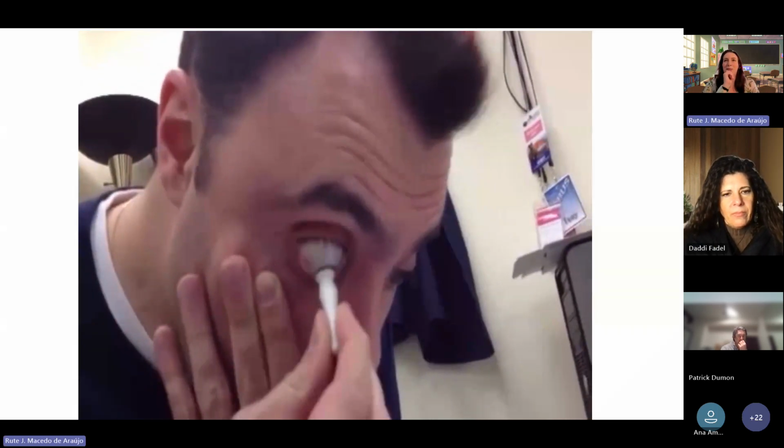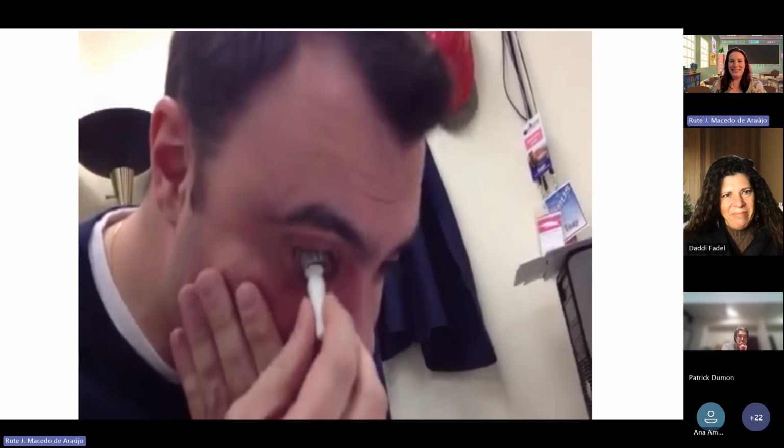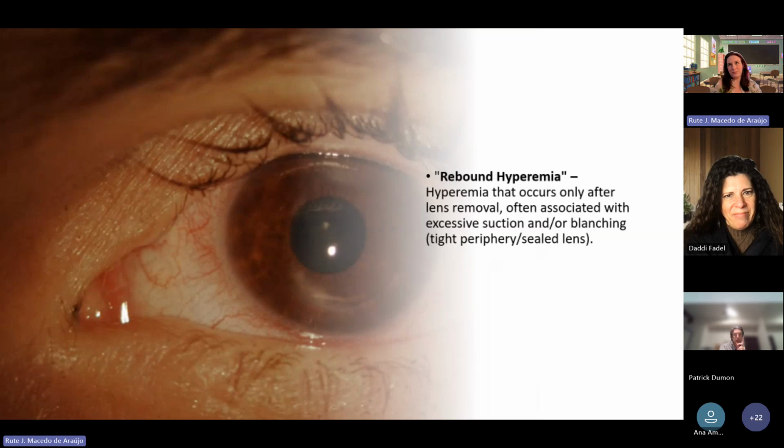And yeah, that's perfect, right? But yeah, don't do that at home, please. And remember, plunger always on the periphery of the lens.